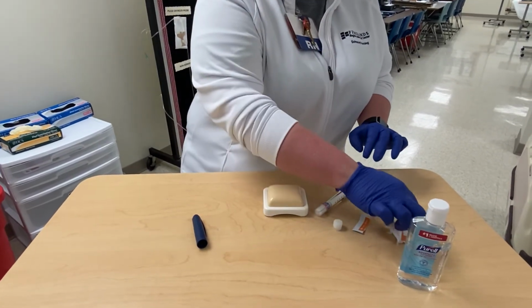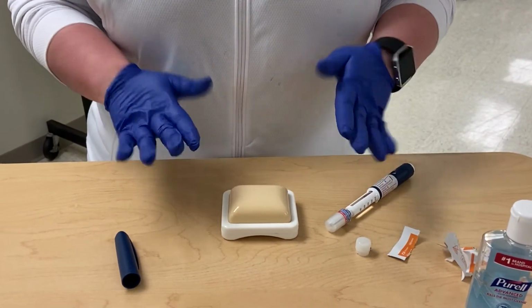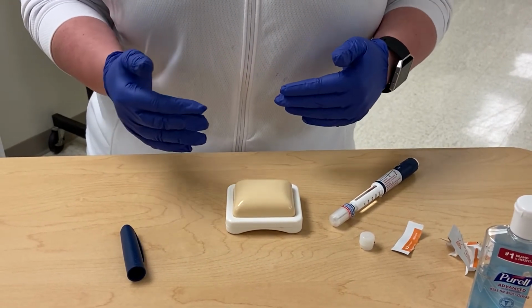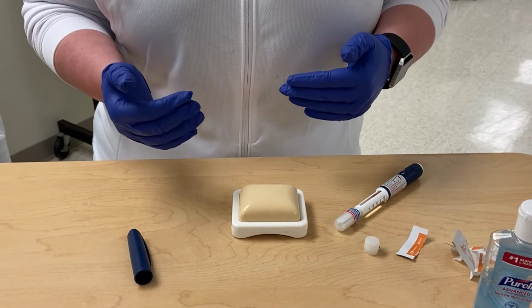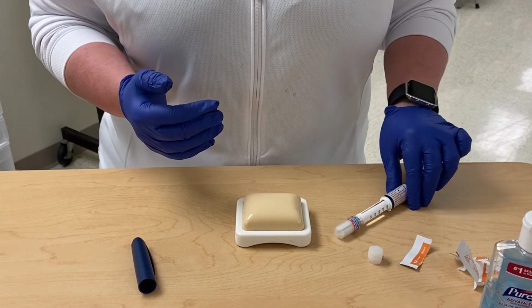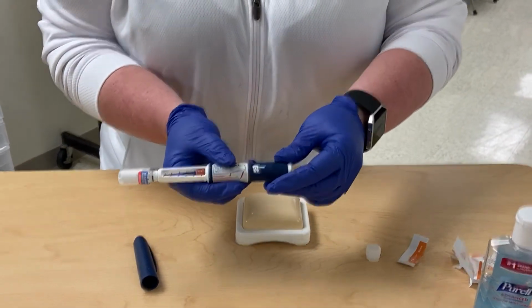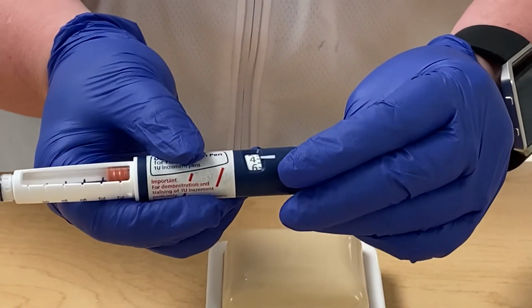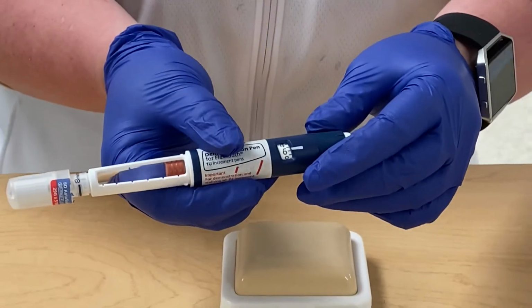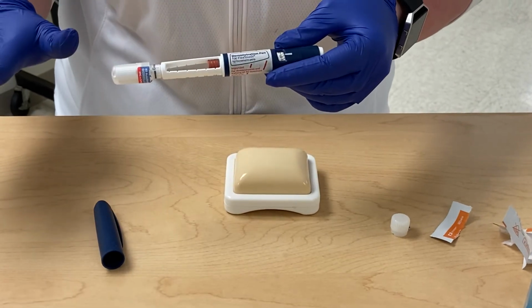Allow the area of the skin to dry properly. Be sure that you have verified the healthcare provider's order, the insulin, and the patient's name and date of birth. By looking at the order, we know that the patient will be receiving 6 units of insulin. So we're going to dial the insulin pen to 6 units, just like that. Verify the dose of insulin with the order.